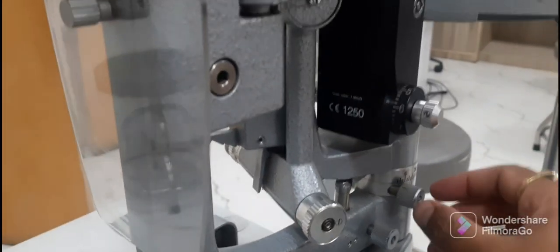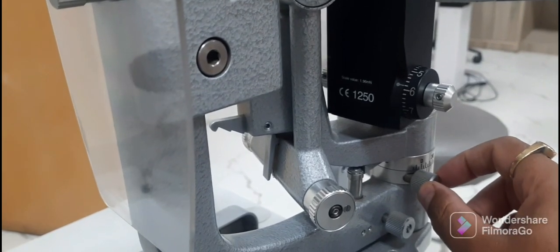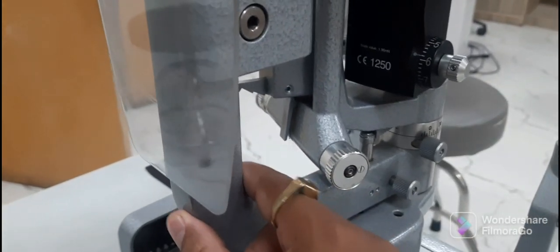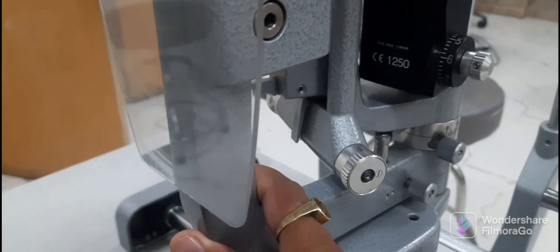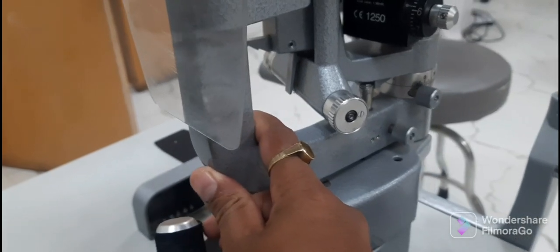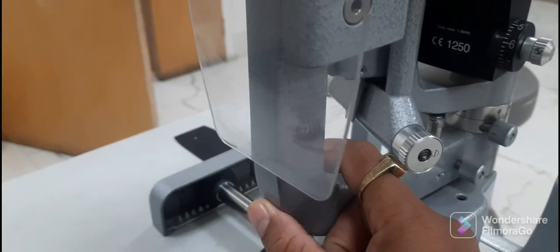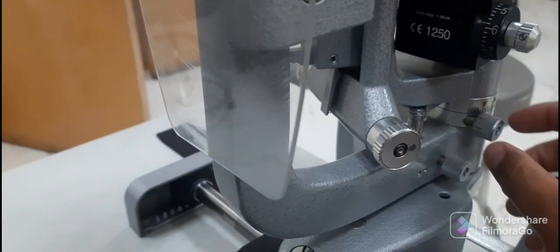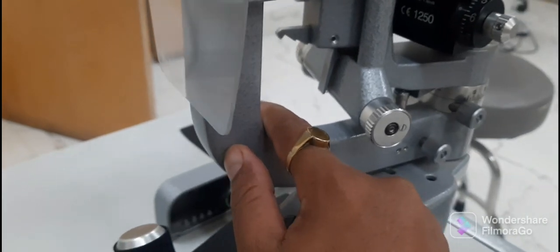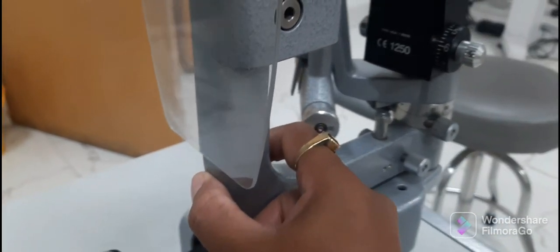There is one more locking screw on all three coaxial arms of the slit lamp, which is used to lock all three arms. When locked, all the arms are not moving independently. When you unlock the screw, the arms move independently. Now you can move each of the three arms respective of each other.